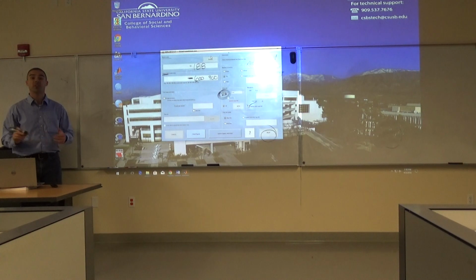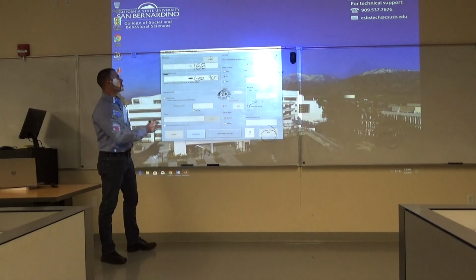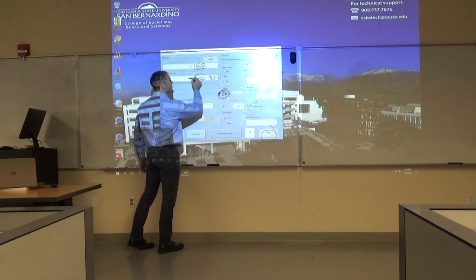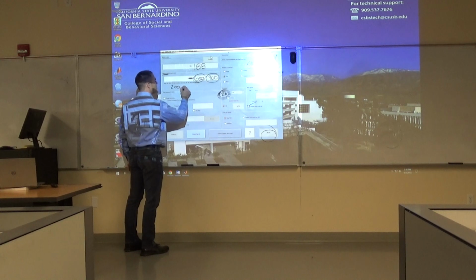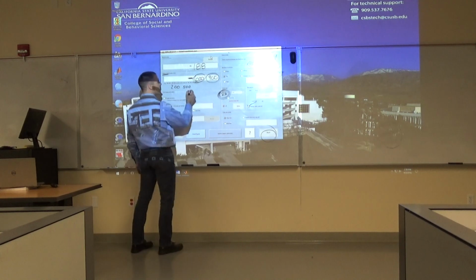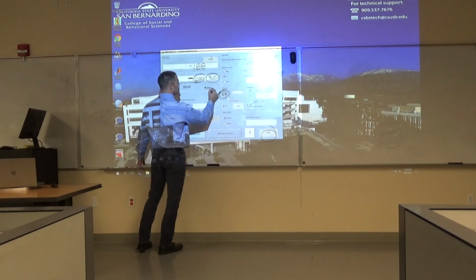Now you should get a nice, pretty, flat, two-dimensional scalp topography map. Do you? Yeah? It's pretty cool, huh? Now what you can do is come back to this and change your times. Say, maybe you want 200 to 500. Or maybe, I don't know, 900 to 1200.